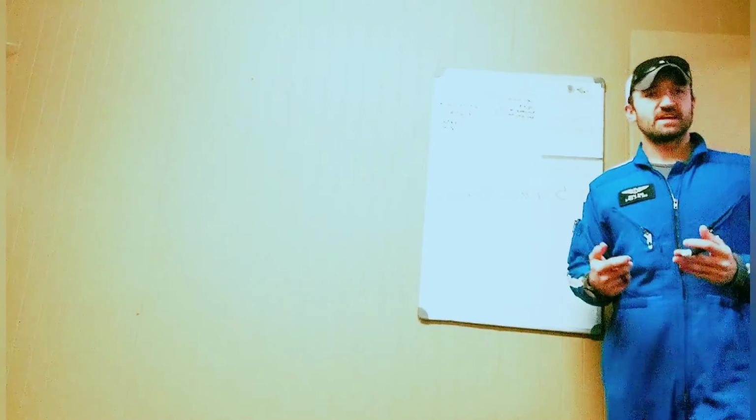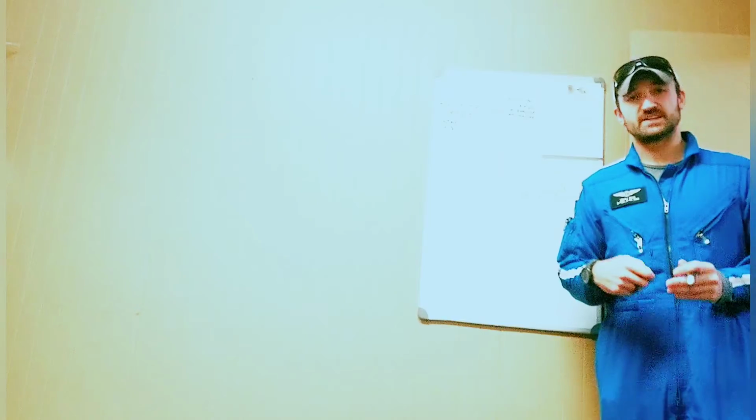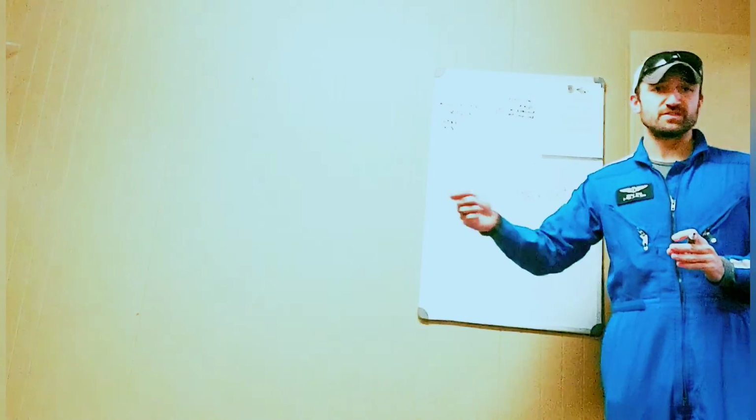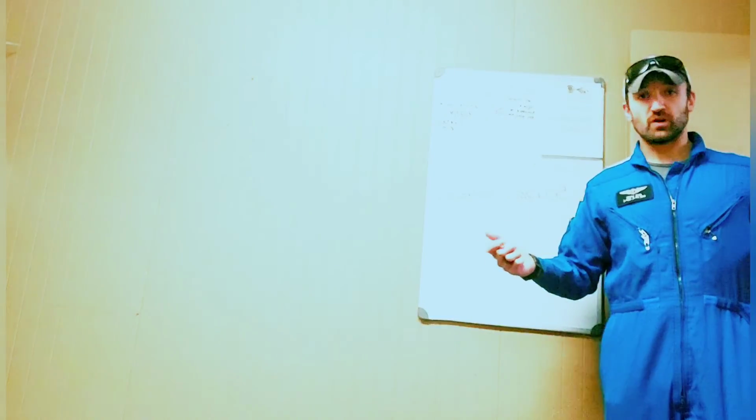The next thing that we're going to do is take that and multiply it by 6. Now remember, the reason we're using 6 is because that's right in the middle of ARDSNet recommendations on that 4 to 8 mLs per kilo tidal volume range.